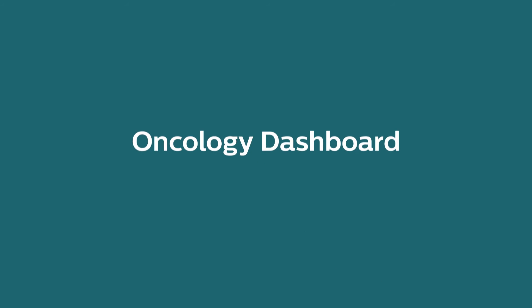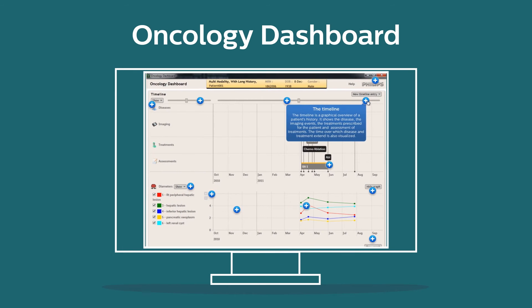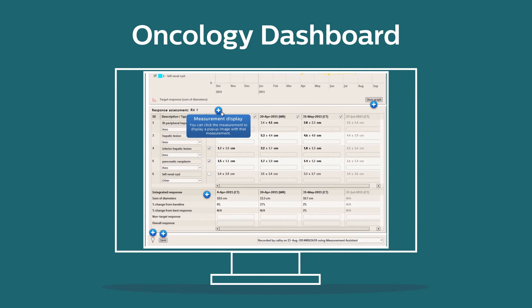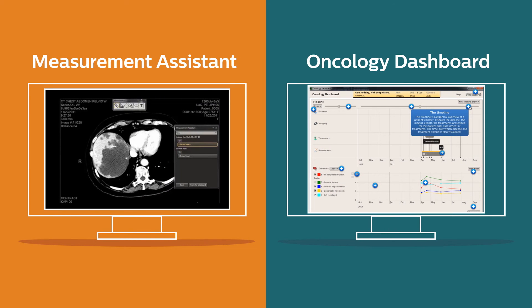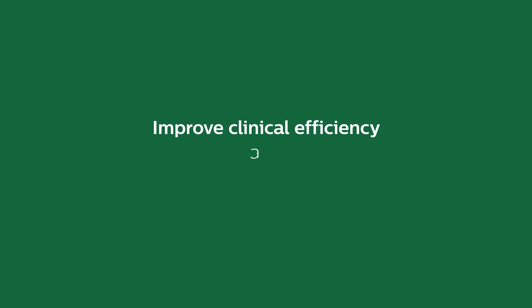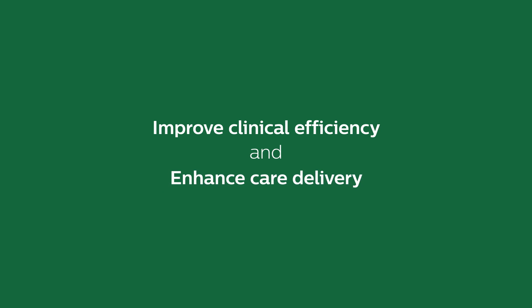Oncology Dashboard integrates Measurement Assistant results with oncology information and provides a holistic, patient-centric overview of treatment and follow-up data, encouraging bi-directional communication between oncology and radiology. This supports a better explanation of disease and treatment response and leads to improved understanding of disease status. The combination increases the value of radiology service to oncologists, which can improve clinical efficiency and enhance care delivery for the patient.